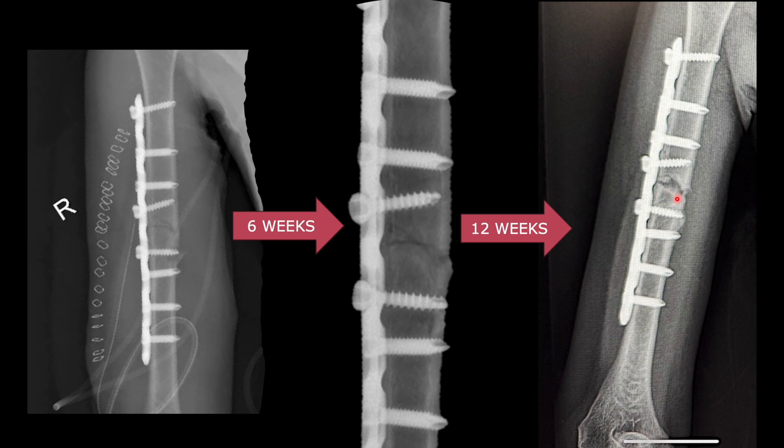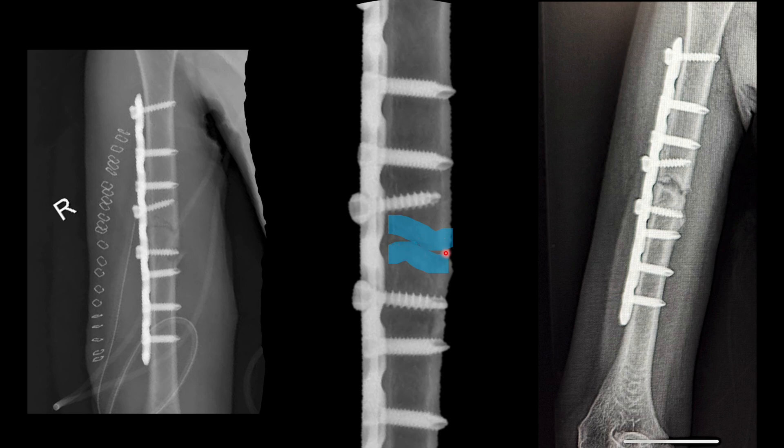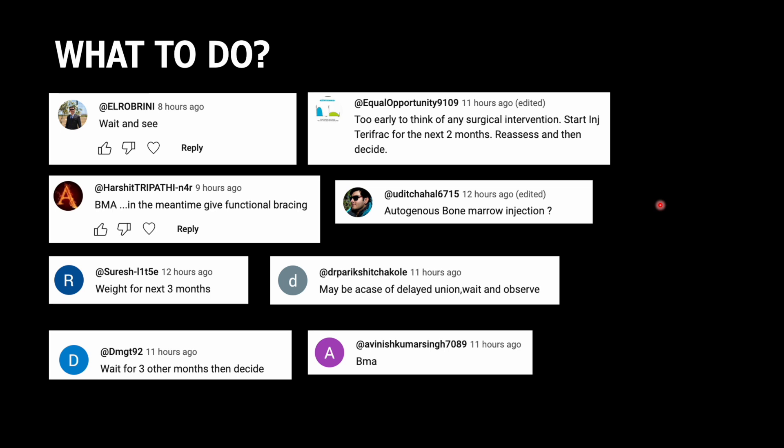The bone laid perpendicular to the axis will now be converted into lamellar bone along the axis of the bone. The gap visible is fibrocartilage that will be replaced by new bone — this is all part of gap healing. When there is a gap at the fracture site less than one millimeter, gap healing occurs, sclerosis happens in subsequent radiographs, and that sclerosis is replaced by lamellar bone. This is the stage when you should not plan surgery at all.